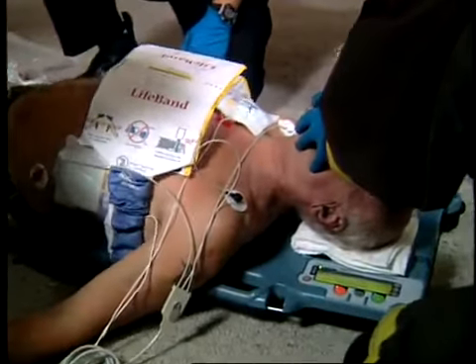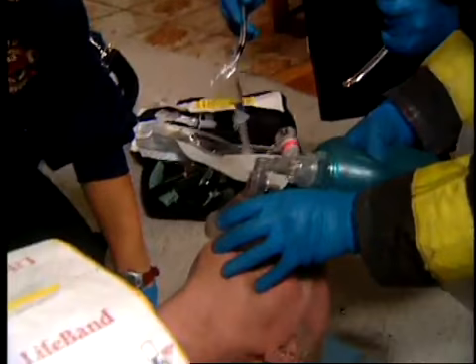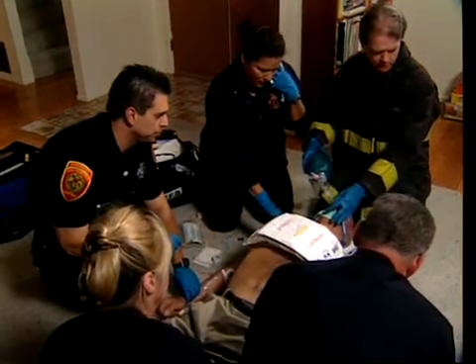Capnography can also be used to gauge how effective cardiac compressions are during CPR, as it's an early indicator of return of spontaneous circulation. The better your patient's cardiac output, the higher their EtCO2 readings will be.